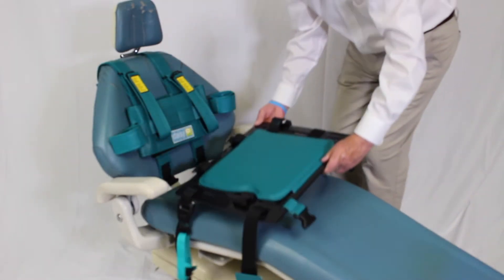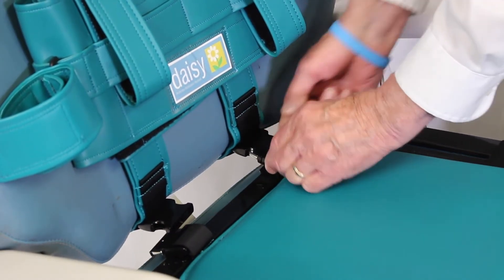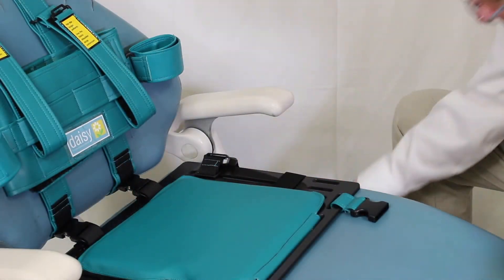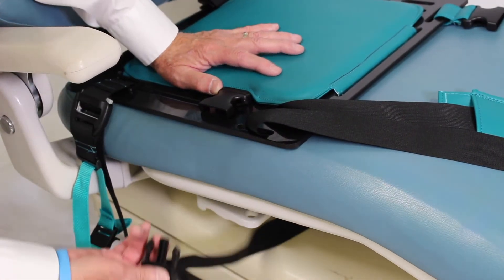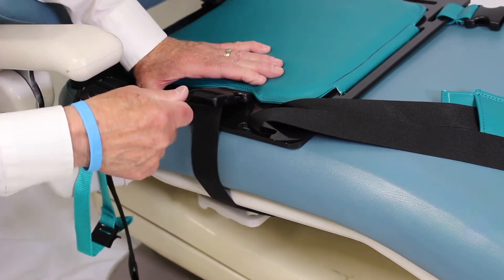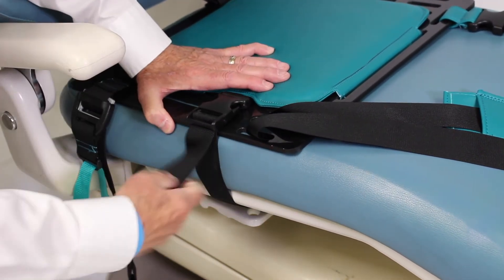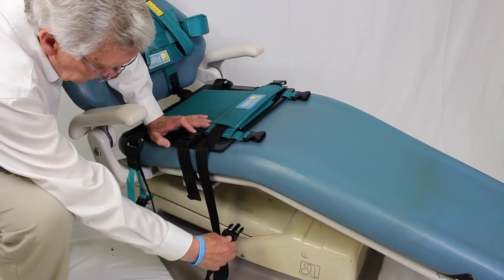Position the seat base on the bottom cushion. Attach the seat base to the harness with two metal buckles. Thread the seat base attachment strap under the dental chair to the other side. Attach that buckle on the seat base. Once this buckle is attached, pull the strap end to tighten on the seat. To tighten, pull the strap end up and down and towards you until the base is tightened on the seat cushion.